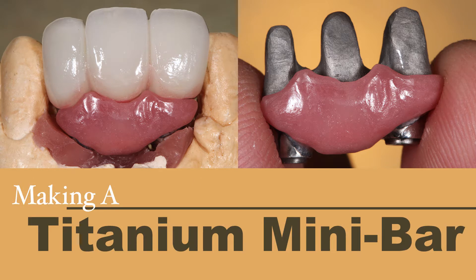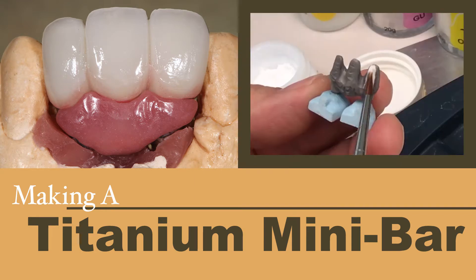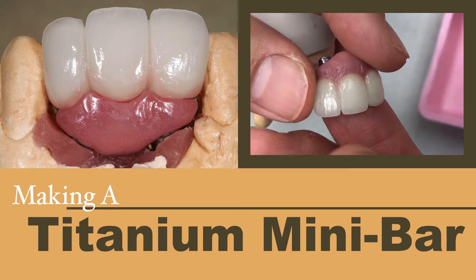In this video, we will show the process to create this difficult 3-unit titanium minibar with porcelain bridge. We will show the design in Exocad, the titanium grinding, the titanium bonding application, and the finished product. Let's get started.